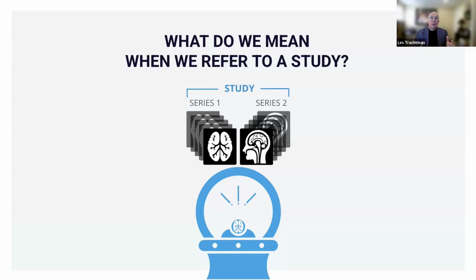When you look at it in a DICOM viewer, you're going to see image by image by image. So you're going to see, for the most part, 2D representations. Now, I think we'll be able to show you, perhaps in today's session, a 3D representation, which is a 3D reconstructed representation. So it takes all these 2D images and puts it together into 3D. And I'd like to say it's the analogy.